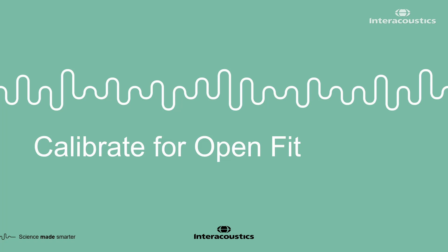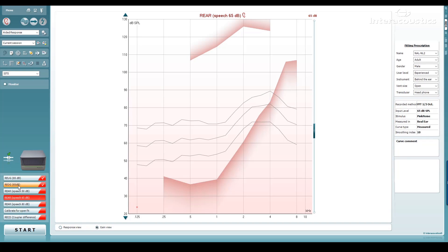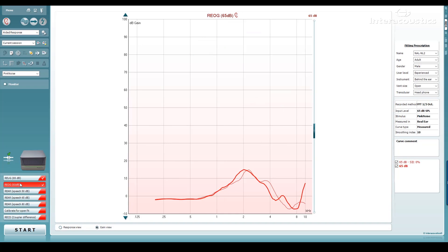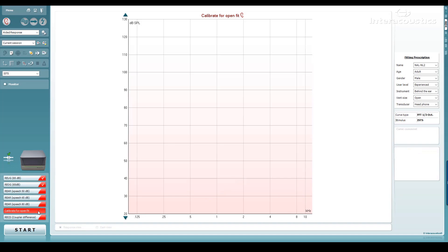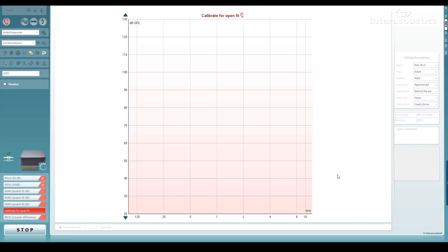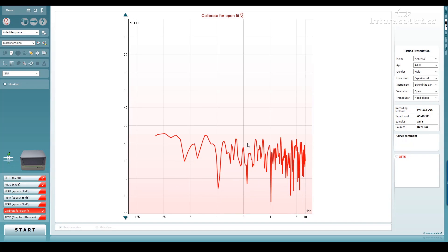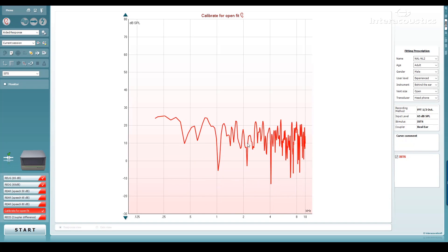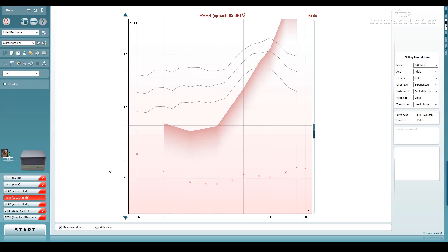The calibrate for open fit measurement performs a process to ensure accuracy when fitting hearing aids which could leak sound — typically open fits or moulds with large vents. Leaving your hearing aid muted, run the calibrate for open fit measurement with the patient placed in the position they will be for the remainder of the measurements. This should be done for each stimulus you wish to use for your aided measurements. The measurement result and the curve shown are not relevant, but the process prepares the system for the aided measurements.